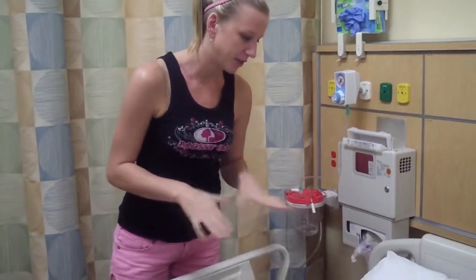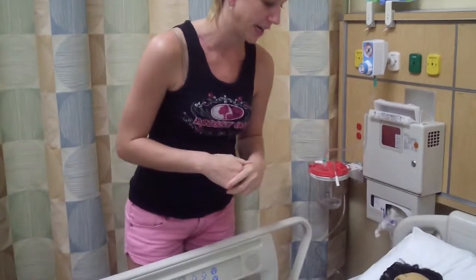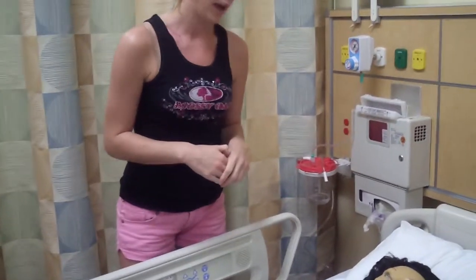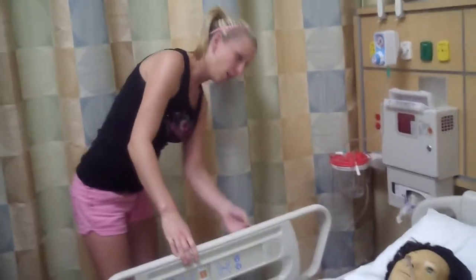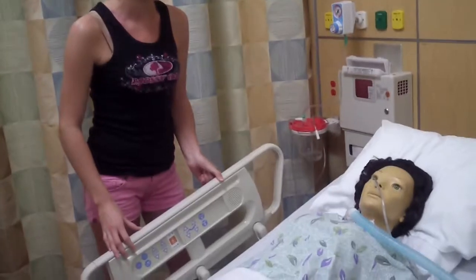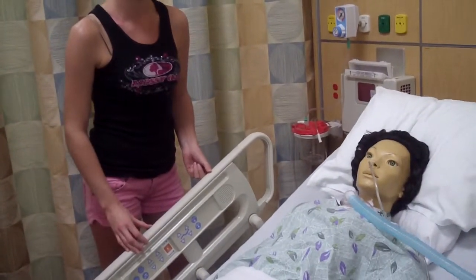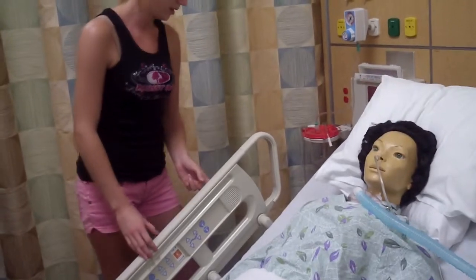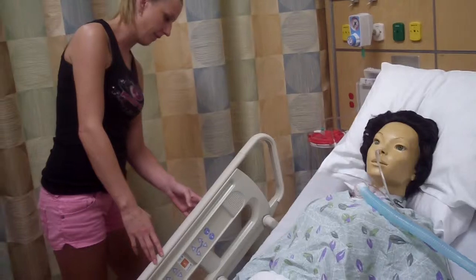If at any time during the procedure you feel like you're having some respiratory distress, we'll stop the procedure. I gave Miss Jones pain medication about half an hour ago, and she said she's not experiencing any pain now. So since the patient is conscious, I'm going to raise her into the semi-Fowler's position. If she was not conscious, she would be in the lateral position. I'm also going to raise the bed at a good working height for myself.